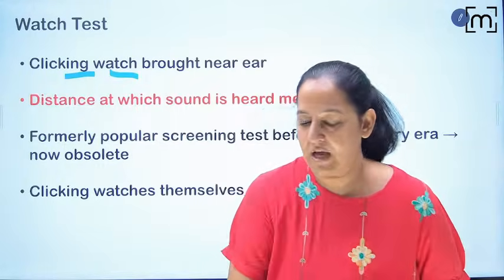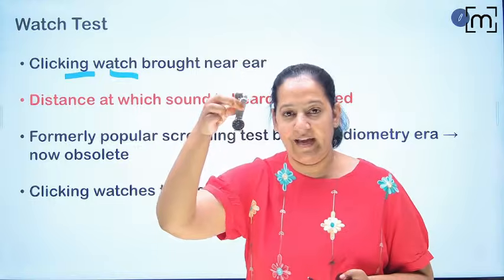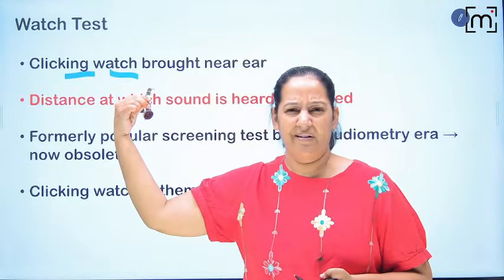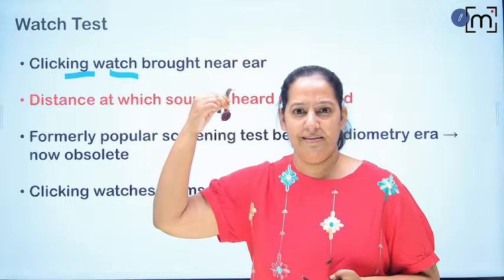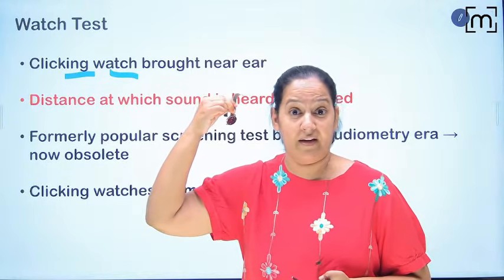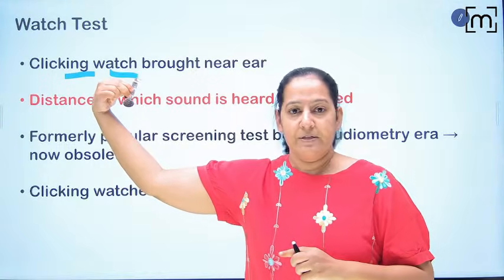Got it? Suppose I'm having a watch over here. You can see this is my watch. It is clicking. So first I will put it here. I can't hear anything. No. Here, still not. Here I guess something. Yeah, I can hear click, click, click. So this distance should be noted. Like this we can perform.